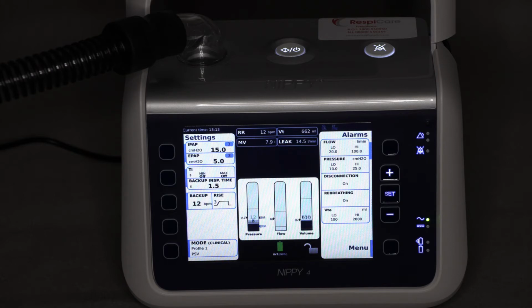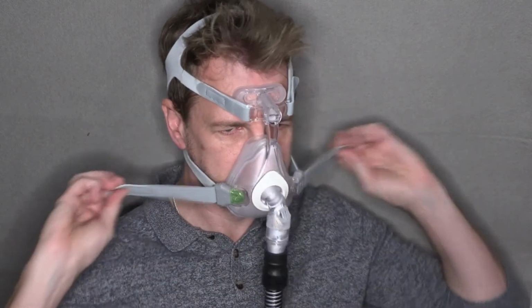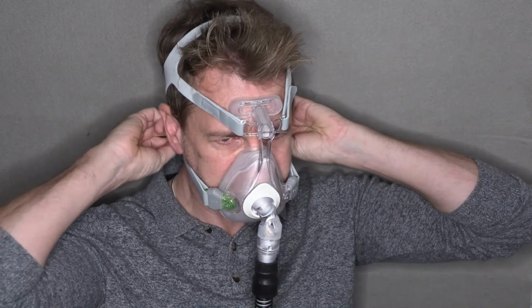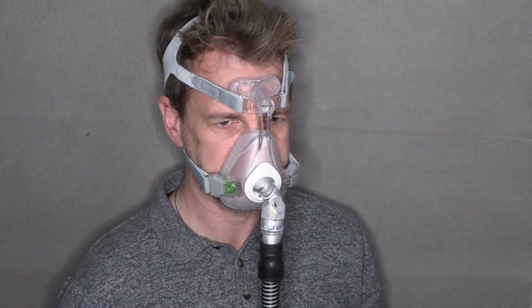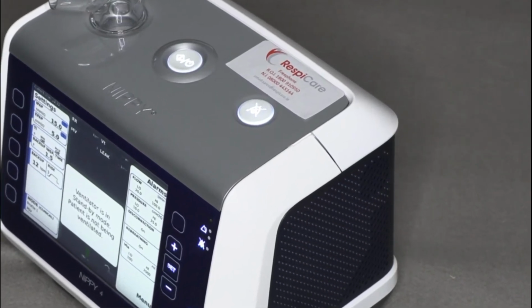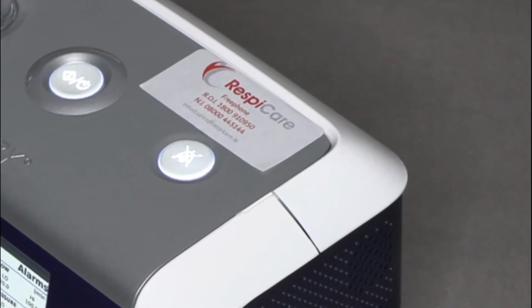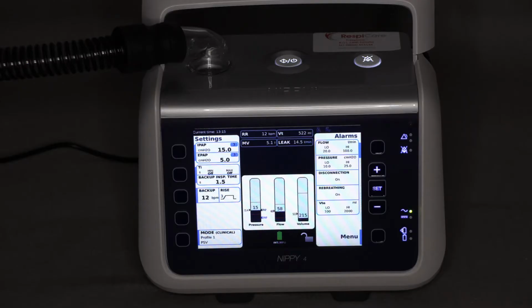If mask leakage is excessive, there may sometimes be an alarm on your Nippy 4 with an on-screen message warning of excessive leak. If this happens, it does not mean that something is wrong with the ventilator, but just means that you may need to tighten the mask more to prevent leak and also to prevent annoying alarms. If there are any alarms or messages that you can't easily understand or resolve, just phone the 24-hour free phone number on the sticker on your therapy device.